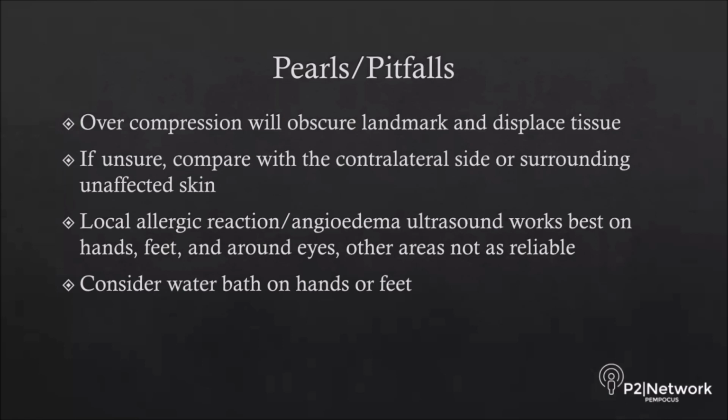If you have periorbital edema. The other areas, I don't find them to be quite as reliable in trying to take a look at the bands of edema.